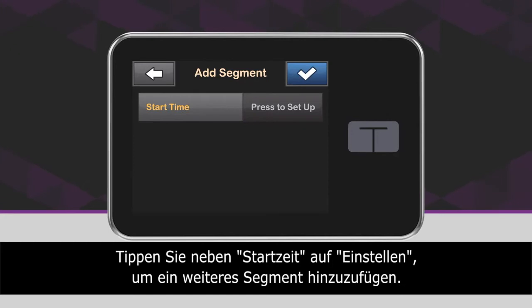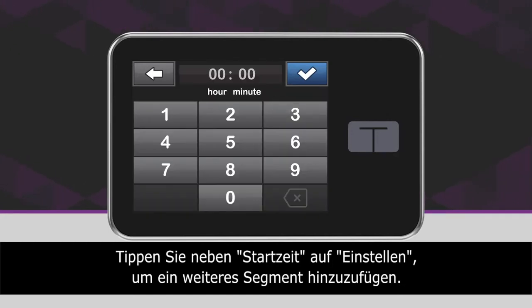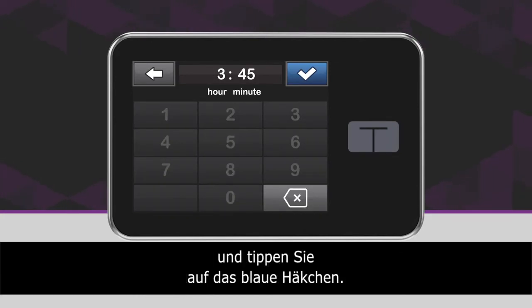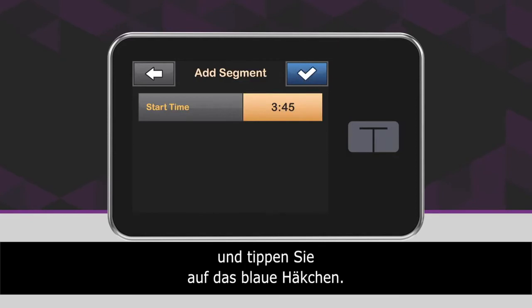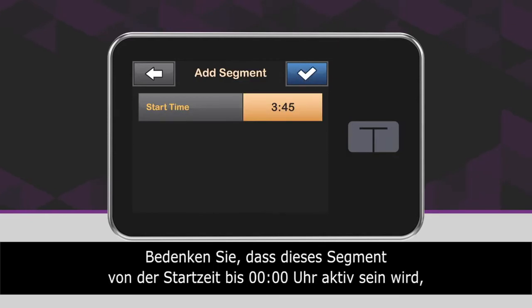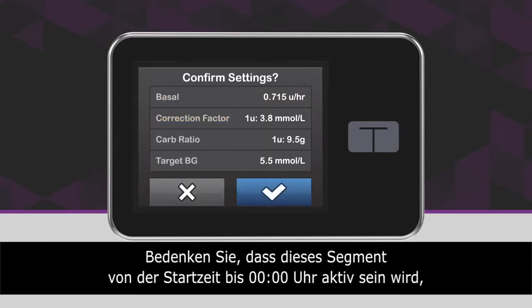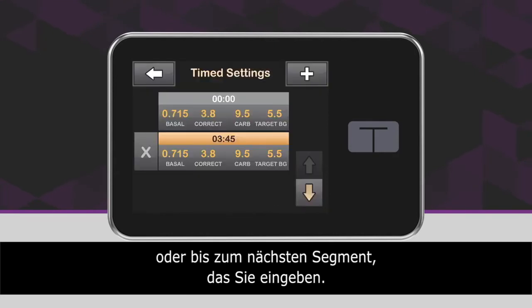On the Add Segment screen, next to Start Time, tap Press to Set Up. Using the on-screen keypad, enter the time that you want the segment to begin and tap the blue checkmark icon. Remember that this segment will be active from the start time until 12am or until the next segment you enter.